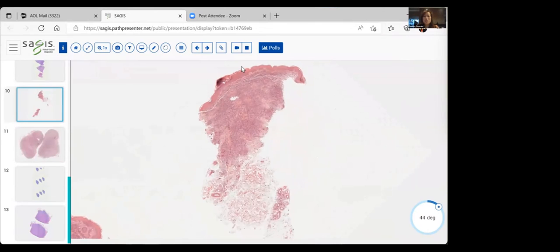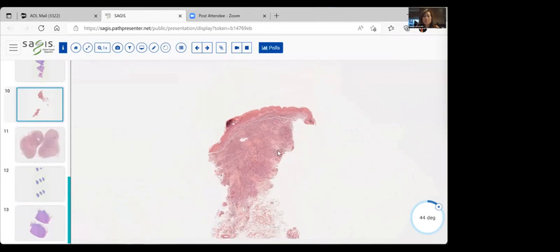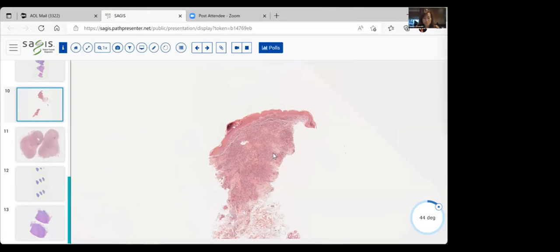And this looks like a large punch biopsy, another really great punch. See how deep they got with this punch biopsy. You see the action in this case is in the papillary reticular dermis. And you see here's the epidermis, and here's the inflammatory portion of the dermis. So let's look carefully at this condition. We're going to go a little closer.